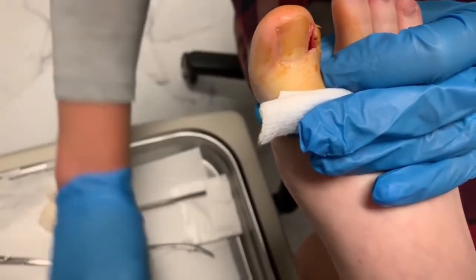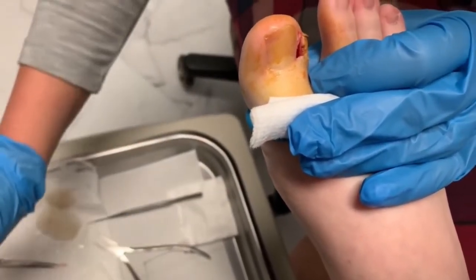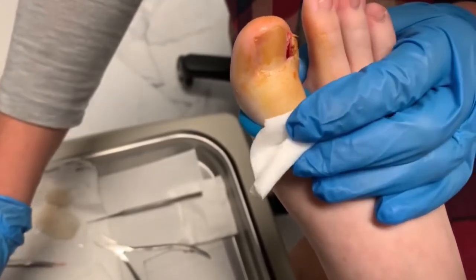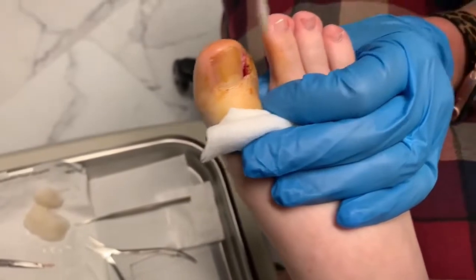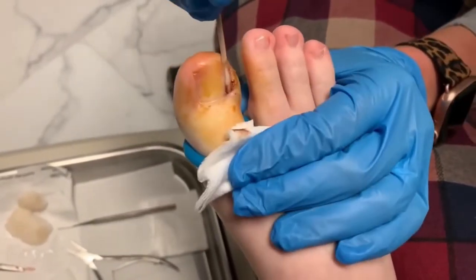Let's go ahead and put the medicine on the root so it doesn't come back. That's it? Yeah, I know. The guy next door just said the same thing — 'that's it?' What did you expect? Glory sweating?